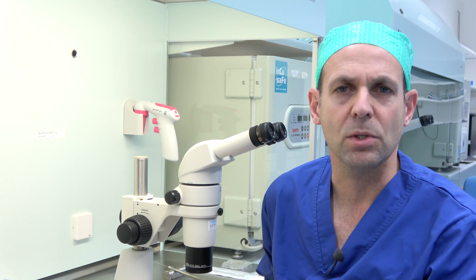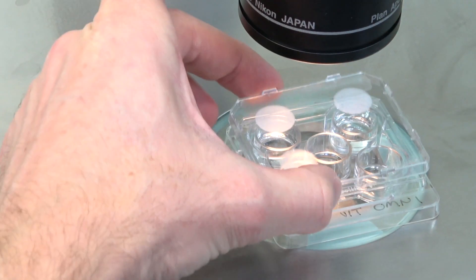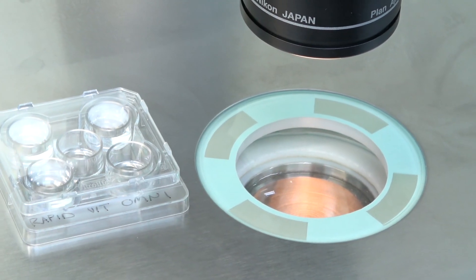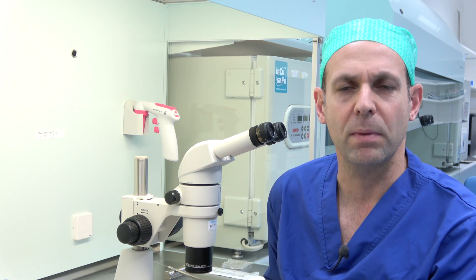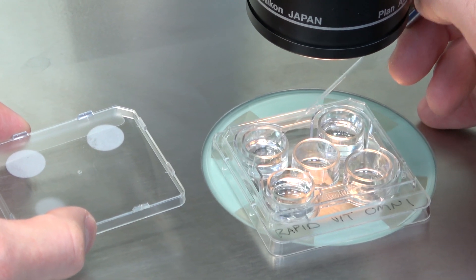Transfer your oocytes or embryos from the culture into the first vitrification solution. Leave them there for a minimum of 5 minutes and up to 20 minutes. After 5 minutes in the first solution, prime your pipette with the second solution and move your oocytes or embryos into solution 2.